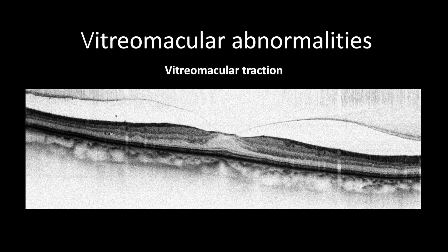OCT is a handy tool to measure vitreomacular attachment. Cases with attachment less than 500 microns have a better chance of spontaneously releasing the vitreomacular traction. In contrast, broad attachment of more than 1,500 microns has less chance of spontaneous release. Therefore, OCT is meant to not only diagnose but also aid in decision-making in cases of vitreomacular tractions.